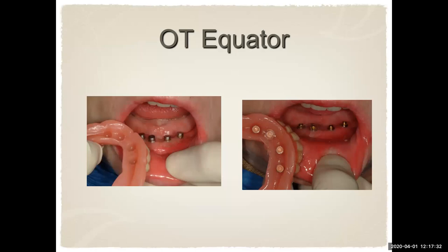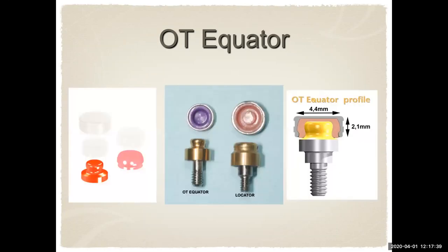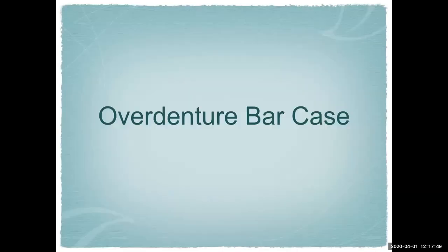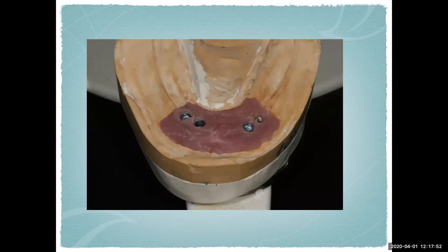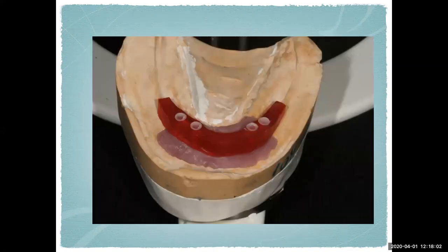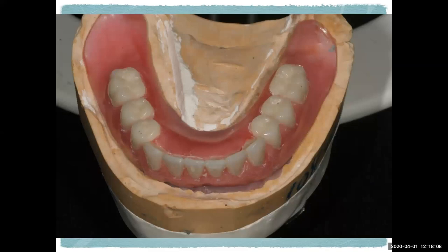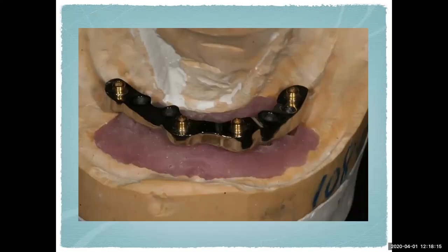This is a particular over-bar denture case where another laboratory was having so much trouble. The verification index was done before I got the case — we tried in the verification index, saw everything was good, had the bite registration, did a denture setup, made a strengthener, and did the bar design with four equator attachments. On the denture try-in, I incorporated the chrome cobalt strengthener and actually processed the attachments to the framework. The try-in went very well, and the finished denture processed and ready to go was a very nice denture.